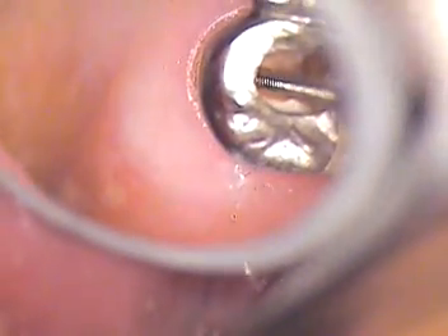Now we're going to try in our post. This post will go in for a try-in. We're finding it's just a little bit tight, so we may end up going with a smaller one.